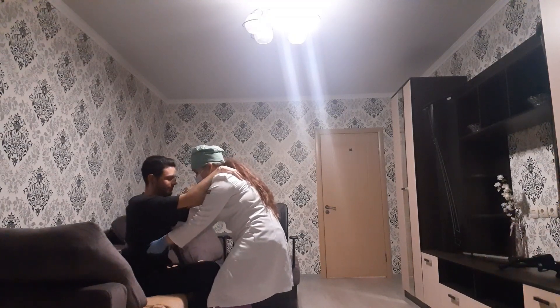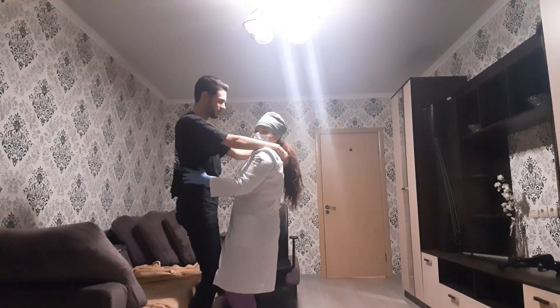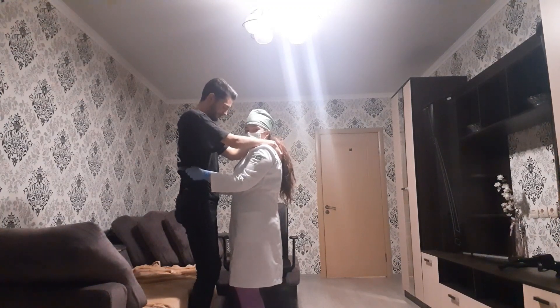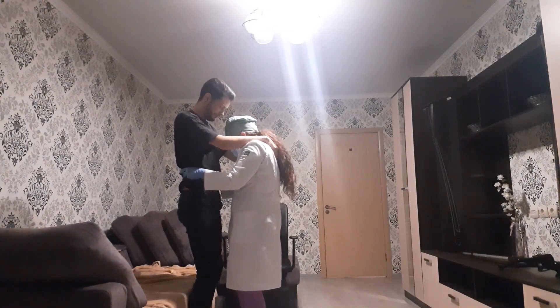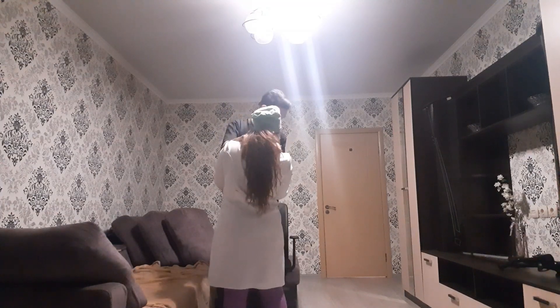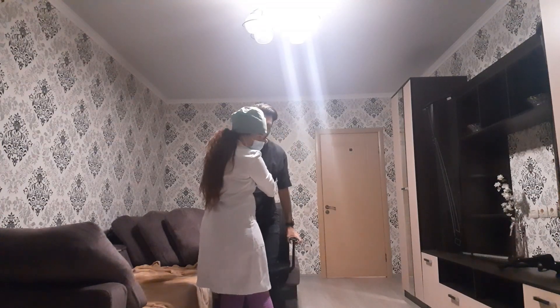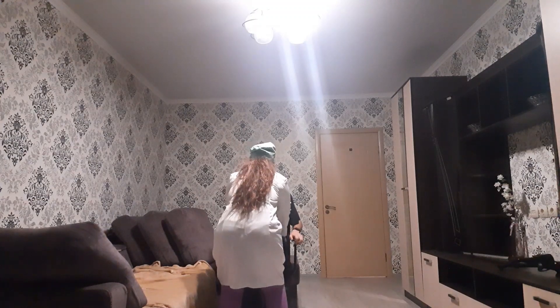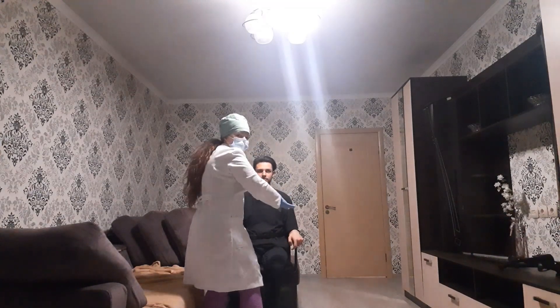Okay. So on the count of three, we're going to stand. One, two, three. Okay. Let the patient take a moment to adjust himself. And then, do a kind of dance with small steps toward the wheelchair that is just behind you. Make sure you do it very slowly. Move very lightly. Then ask: Mr. Dylan, please put both of your arms on the armrests. Help him sit down very slowly. Make sure the brakes of the wheelchair are locked so the wheelchair will not move.